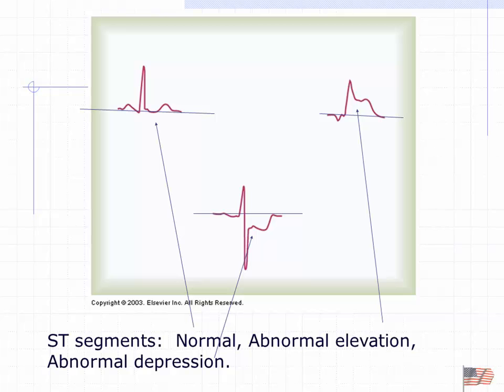And we should be able to identify elevation and depression: ST depression, ST elevation. Ischemia, injury.